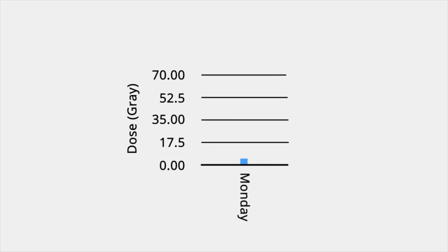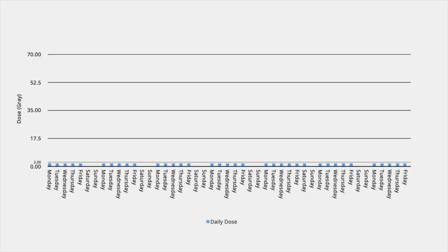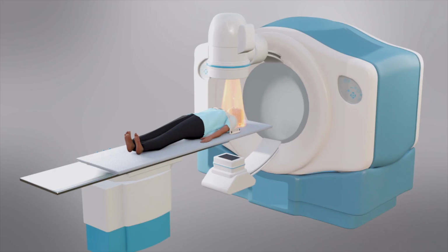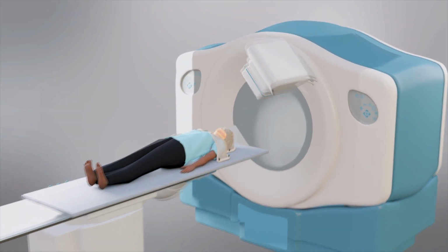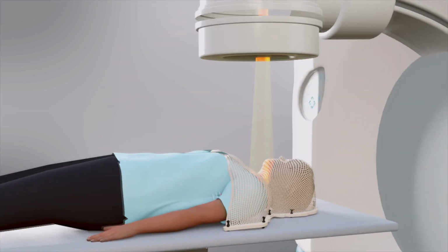Instead of giving the entire radiation dose in a single day, which would cause excessive damage to normal tissues, smaller radiation doses are given each weekday to improve outcomes. Collectively, the total dose still reaches the desired level. Furthermore, the radioactive beam is rotated continuously around the cancer to ensure healthy tissue is not overly exposed, but collectively, keeping the focus of the radiation beams all centered on the cancer itself.